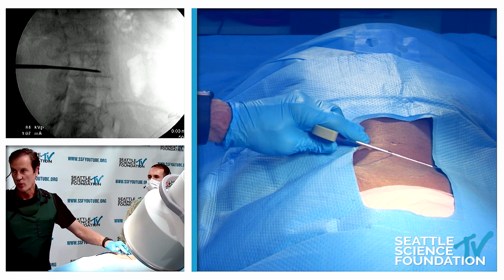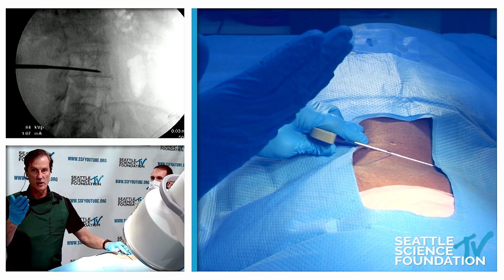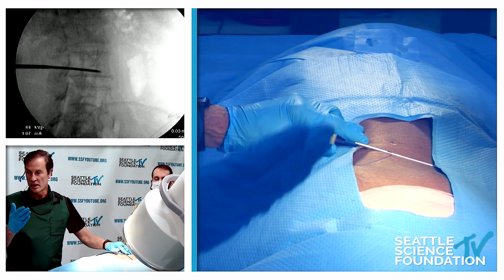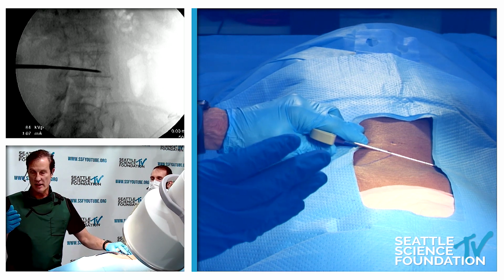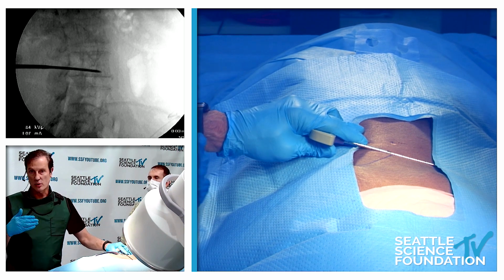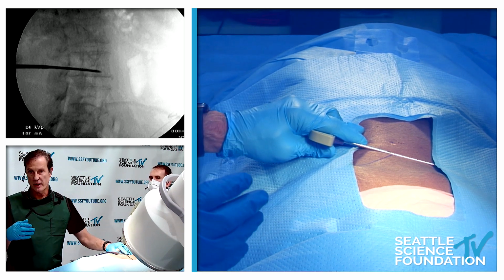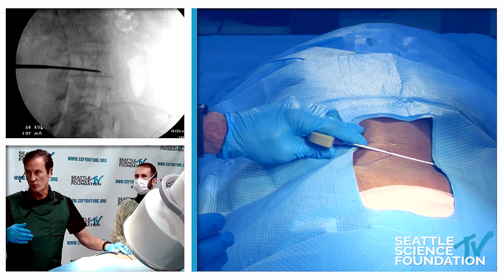So this is our start point for the Modified Inferior In-Plate Extrapedicular Approach. It's 45 degrees off midline in the lumbar spine, 30 degrees in the thoracic spine. The start is just above the inferior end plate. If you go anterior to that, that's big red and big blue. If you go posterior to that needle tip, that's where all the neuroforaminal structures lie, and that's where the descending ventral rami go. So these are motor nerves, important real estate.